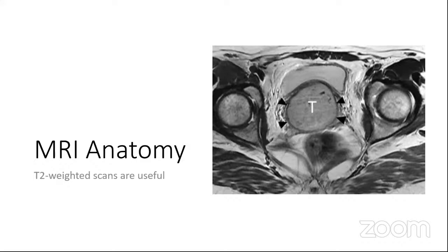Of course, I'm talking about the imaging that is required for planning purposes. For diagnostic purposes, PET CT might be useful in metastatic evaluation, and MRI could also be useful in noting down the local stage of the disease. But as far as planning is concerned, we are going to use CT scan and MRI. In most institutions, even in mine, we are not using MRI in routine contouring, since we have long waiting lists for routine MRI scans in our common radiology departments. So unless we get a dedicated MR scanner, we might not be using it until then.